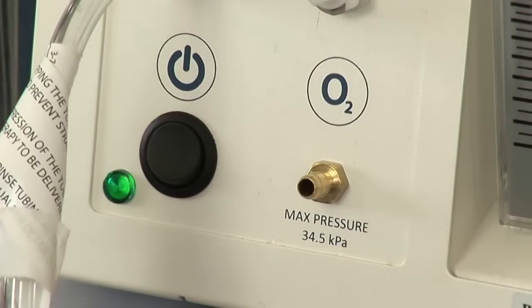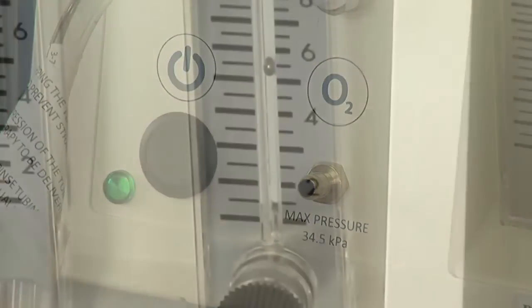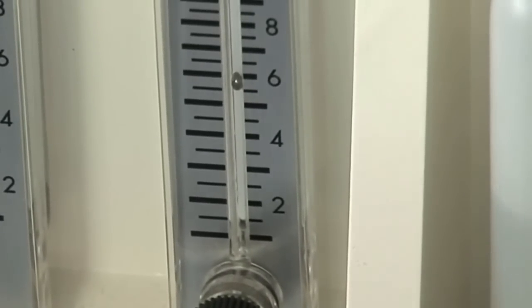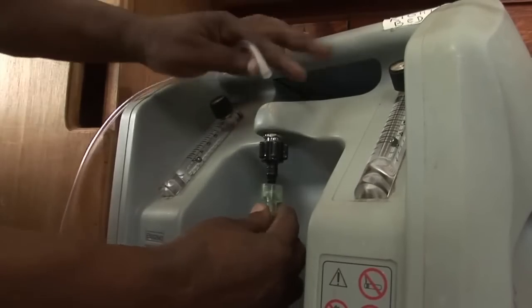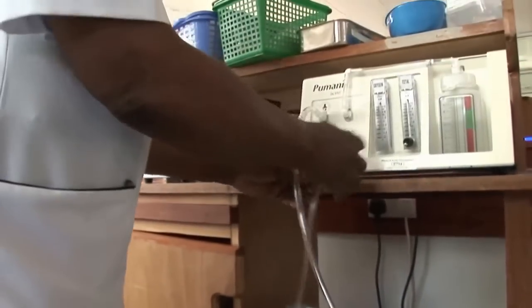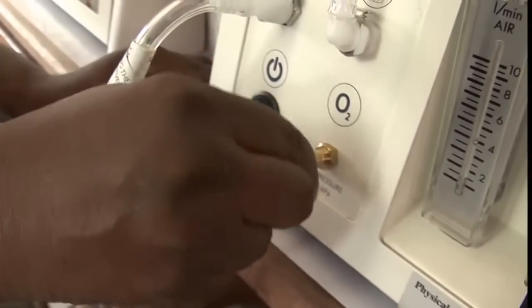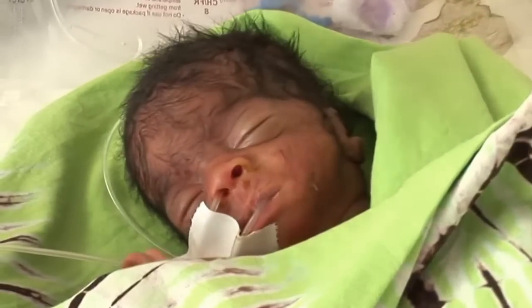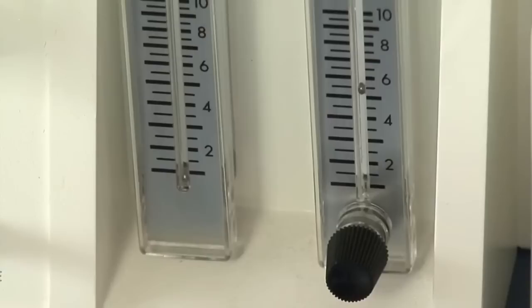Make sure the C-PAP machine is on and that the total flow is at 6 litres per minute. Then attach the tube that will go from the oxygen concentrator to the outlet marked O2 on the machine. This baby is very small so the oxygen is set at 3 litres per minute.